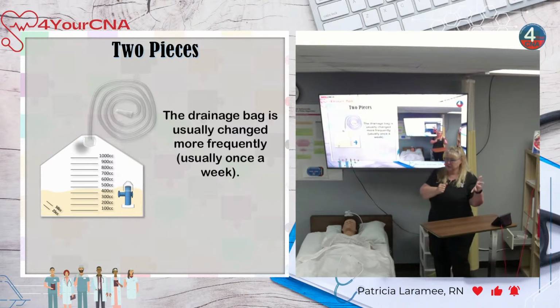So catheters up to 30 days, bags more frequently, usually about once a week, but it depends on where do we go for information? Care plan. Care plan will tell us how often to change that bag. Good?